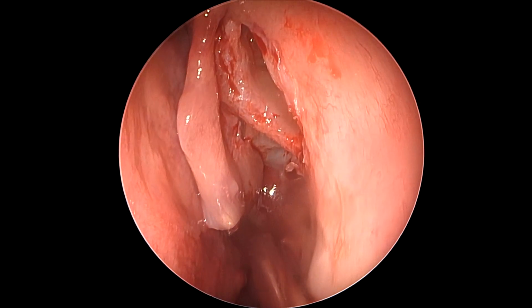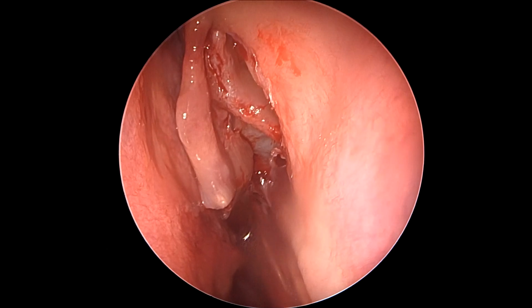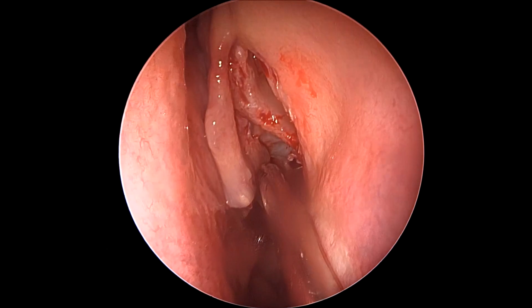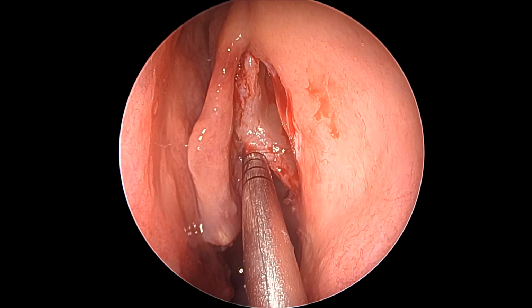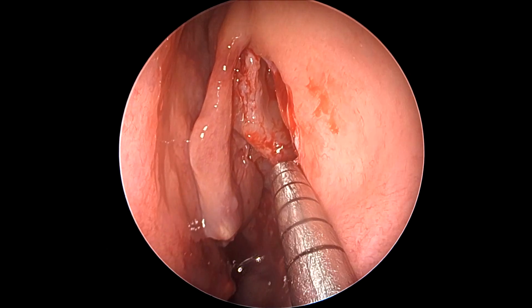You can see a partially open bulla here, which again will be removed by engaging the curette behind its posterior wall. Frequent irrigation helps keep the surgical field clean.